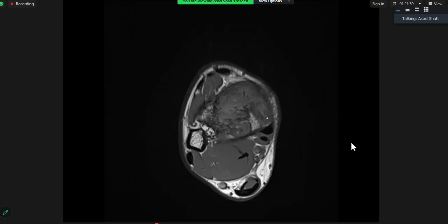Let me stop you there. For all of you, don't use the term zone of transition on MR. That's a sin. Zone of transition is the term to be used on an X-ray. On MRI, even very aggressive tumors will be well demarcated from the normal marrow for the surgeon to cut above it.